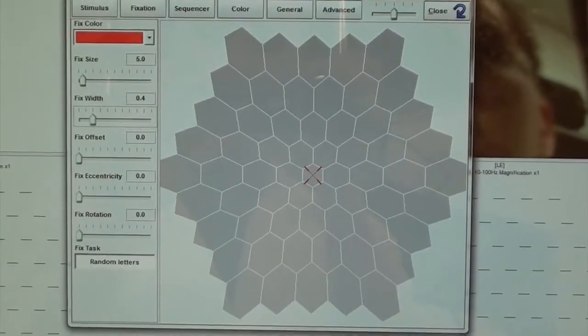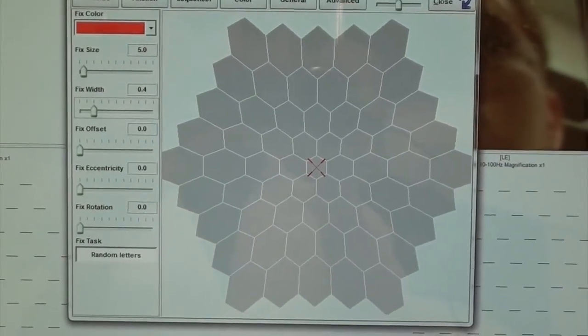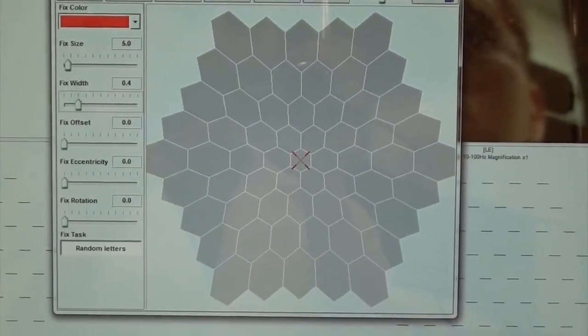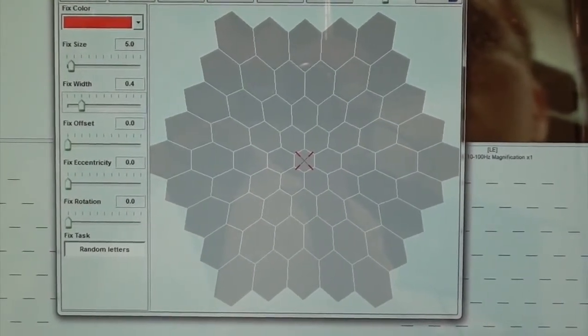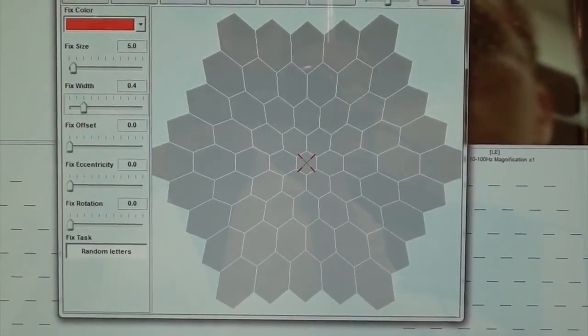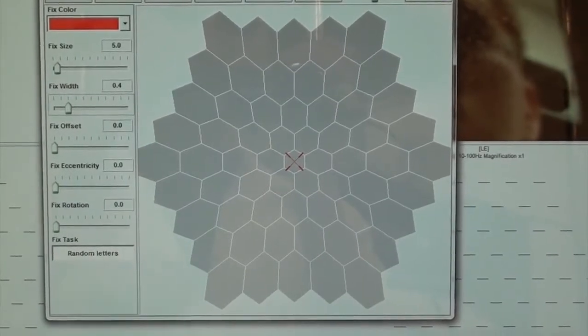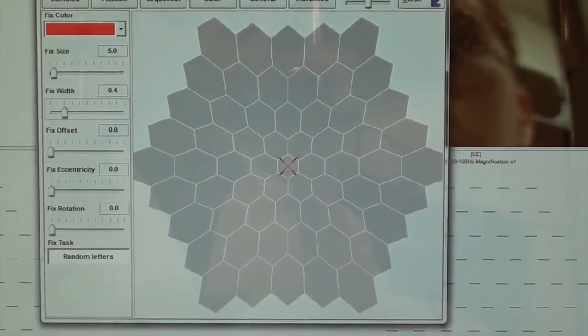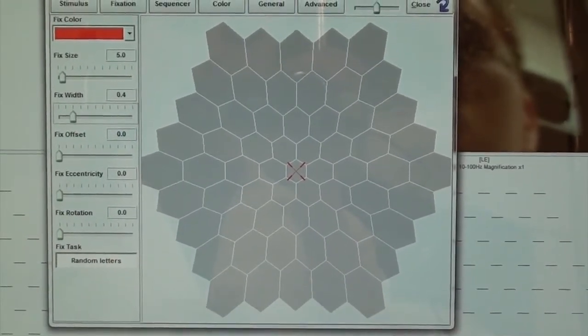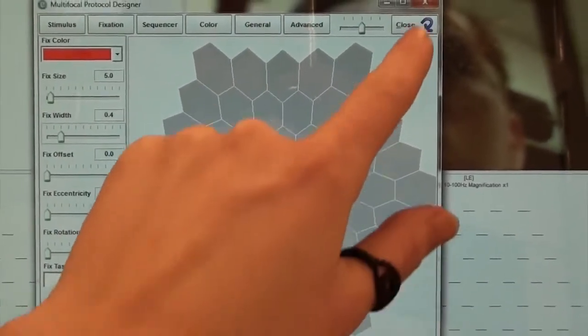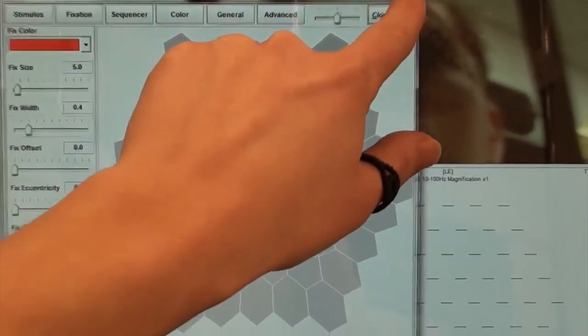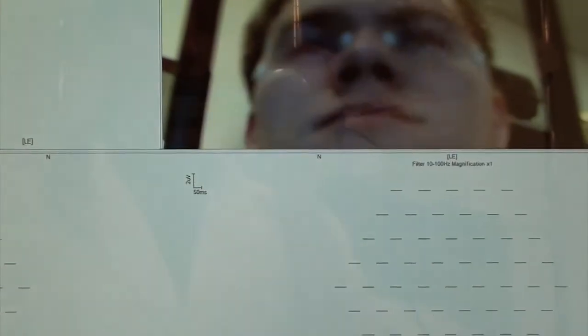Only change it as much as necessary, trying to make as much of the hexagon visible as possible. When the patient can see the red X, close the window.